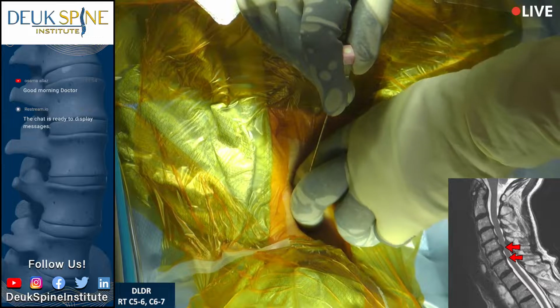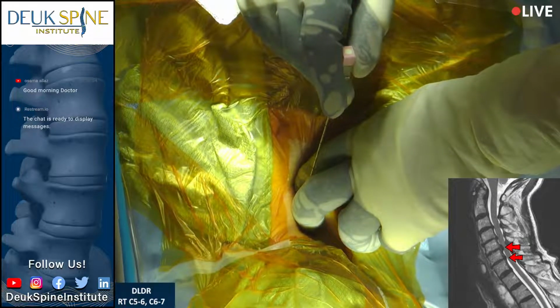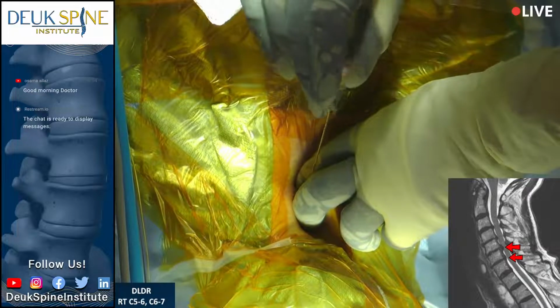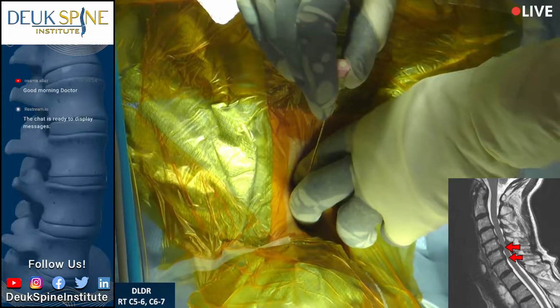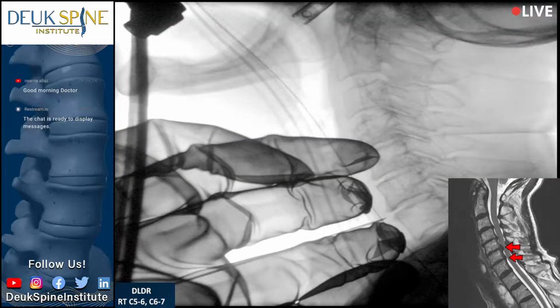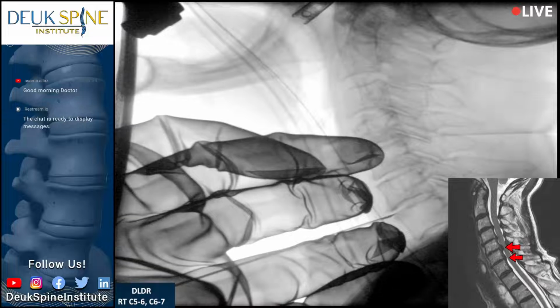2, 3, 4, 5, 6, 7. Looks like I'm sitting right above 6-7. You agree, Monica? Yes, sir. All right, so I'm going to come south. Luis, yes? Shot? Yes, sir. Perfect. Give me a shot and then an AP. AP quick.